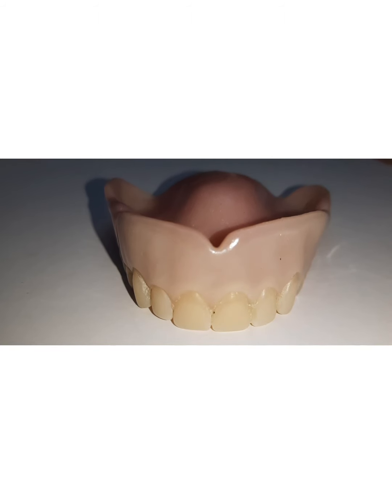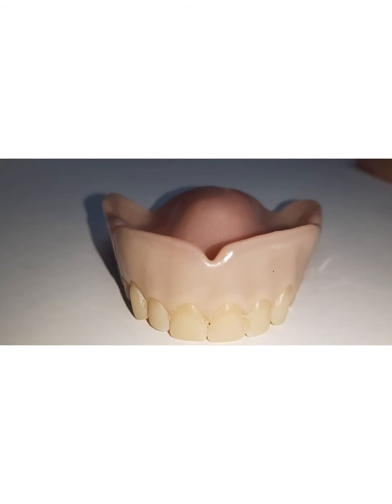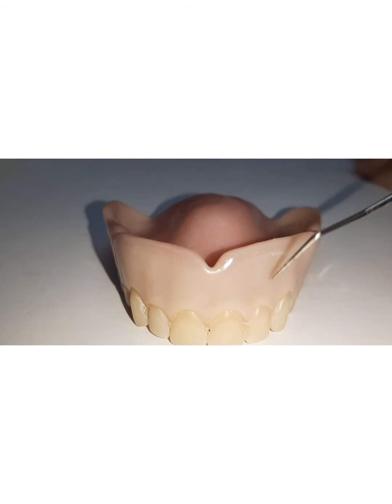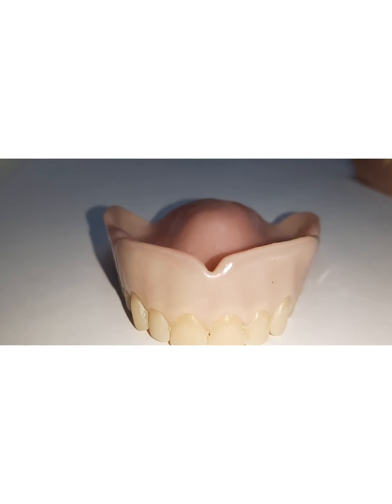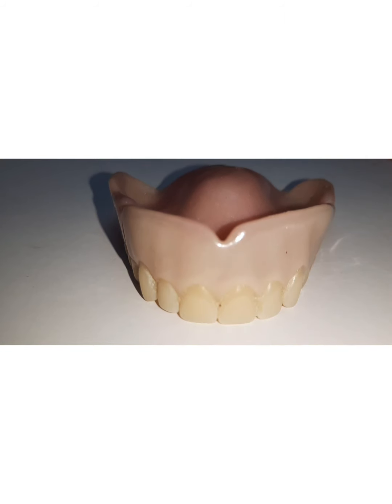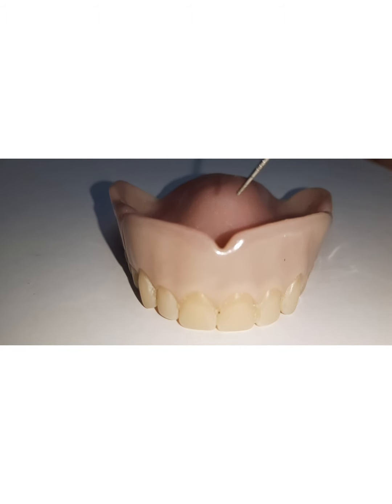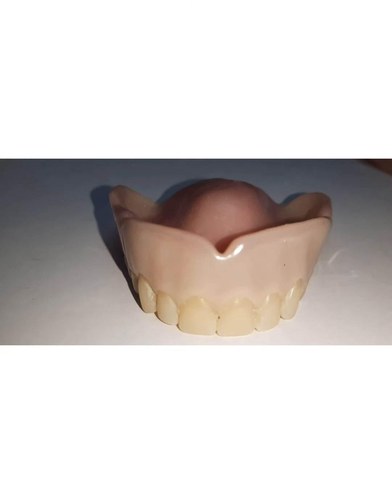The labial flange provides the lip support, lip fullness, and aesthetics. And if the labial flange is too thick, it will give an artificial look to the denture. The patient will never be comfortable. If this area is too thick, then the patient will have kind of a ballooning face, and the patient will never be comfortable during functions or speech. Also, the labial flange has a V-shaped notch in the center, which is to allow the accommodation of the labial frenum, which is a passive frenum, and that is the reason this notch is given in the labial flange.